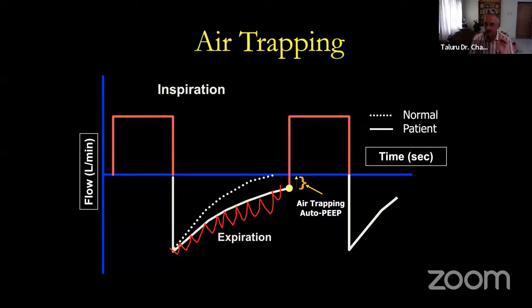It is quite accurate. And if there is a lot of water because of a humidifier, which we probably don't use in an ICU situation, humidifier sometimes produces a lot of water particles in the circuit. So that has to be considered. So these two things are very easy to pick up. These two things you have to remember.